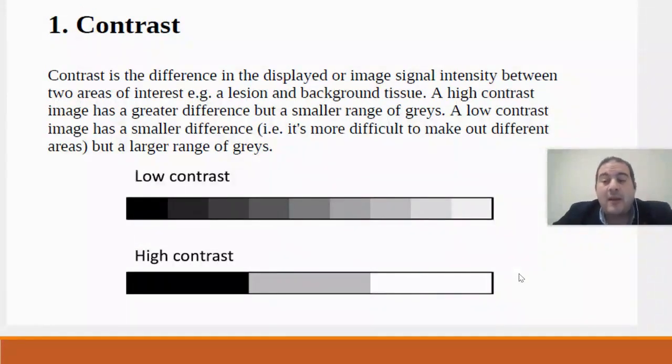The change in milliampere settings cannot easily be addressed in post-processing with screen film, but when working with digital radiography, you have the opportunity in post-processing to make adjustments such as enhancing contrast.